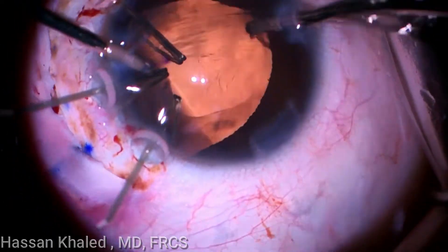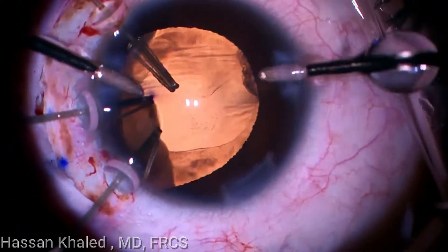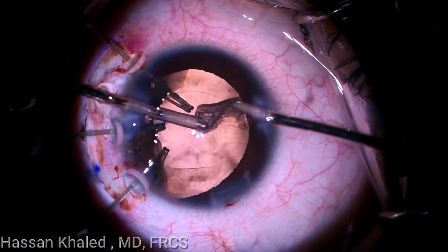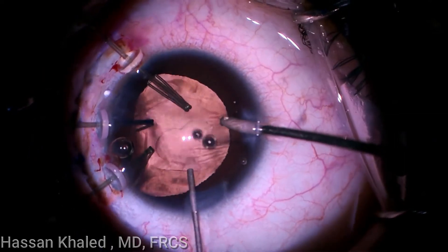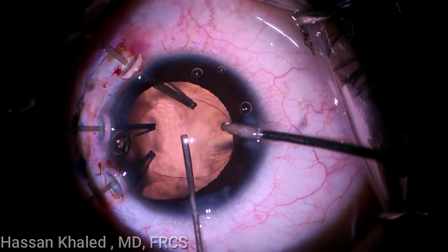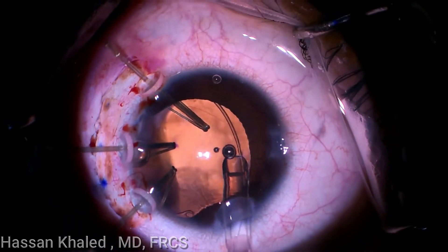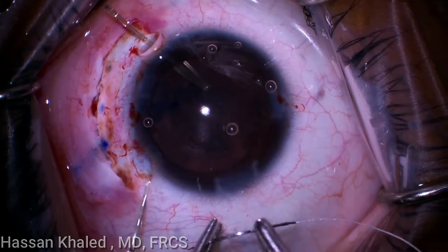One important trick is to fill the capsular bag with OVD before pulling the irrigation probe out of the anterior chamber. Now a capsular tension ring is implanted inside the capsular bag, as you can see.